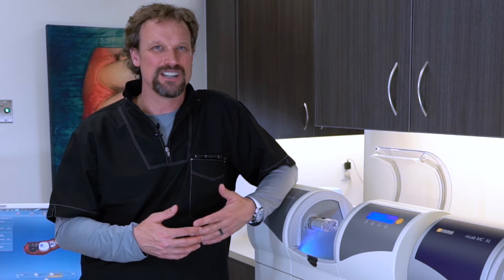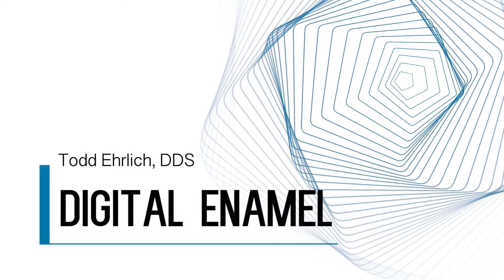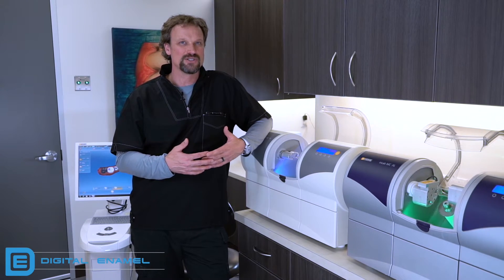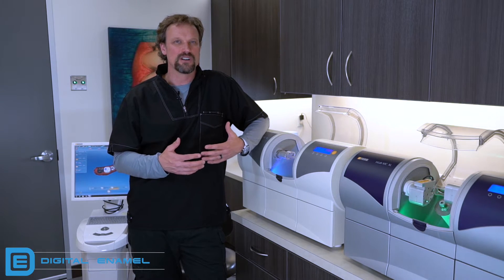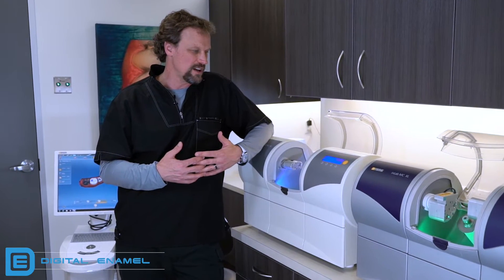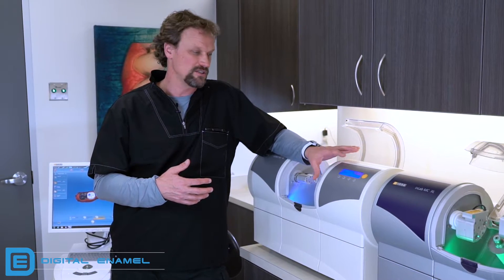I'm going to show you how to calibrate the MCXL. The first question is when would you do that? You should probably do it after any major software updates, or if you get a couple restorations that should have looked better and they just didn't. Maybe something went wrong in the calibration of the MCXL, but they don't go out of calibration very often, so this isn't something you're going to do many times. If you move your milling chambers, for sure you'd want to calibrate them.